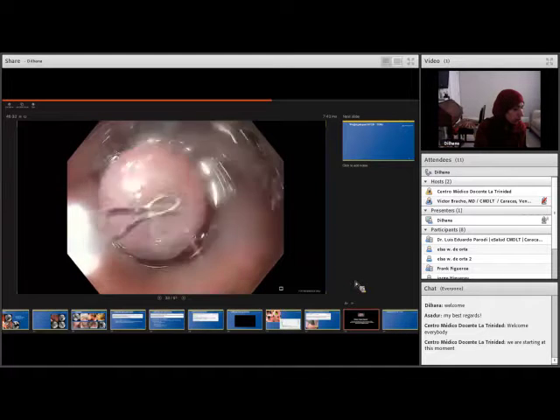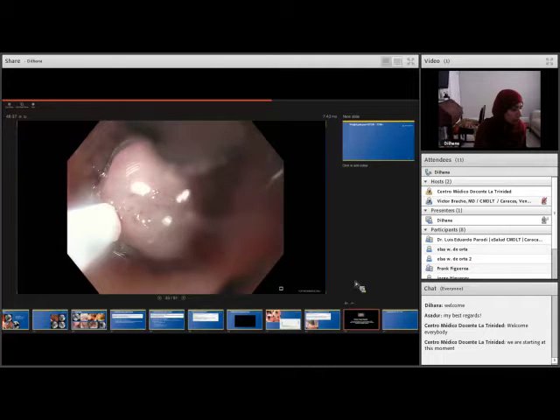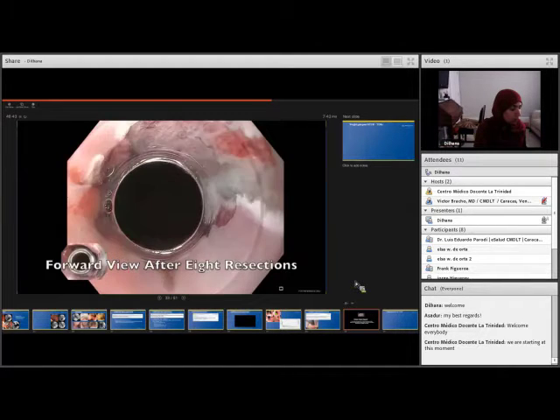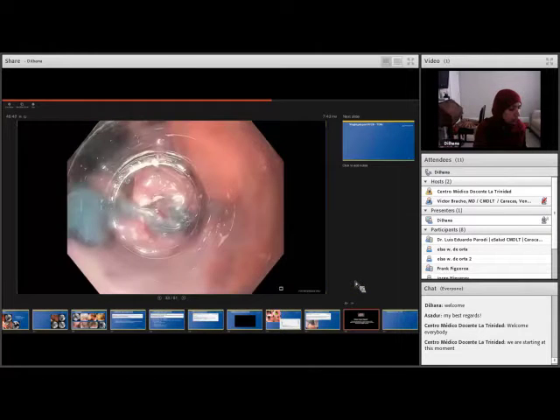This and prior ARMS procedures have been performed with a resection rather than a band and slough technique. Theoretically, the use of the band and slough technique may have a lower bleeding risk. However, it may not provide the same clinical results due to unclear impact of mucosal bridges between the bands.